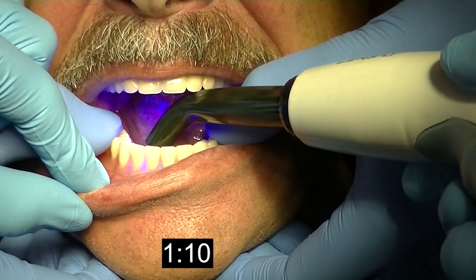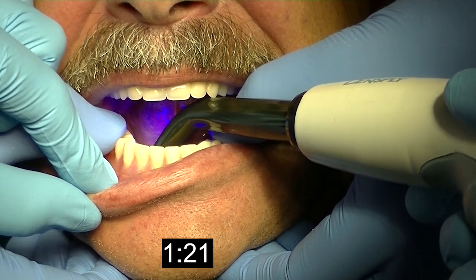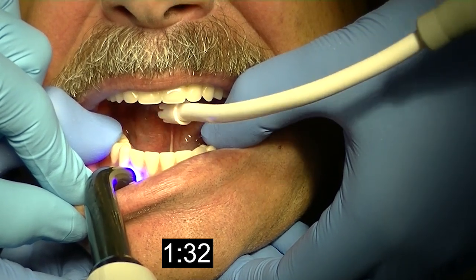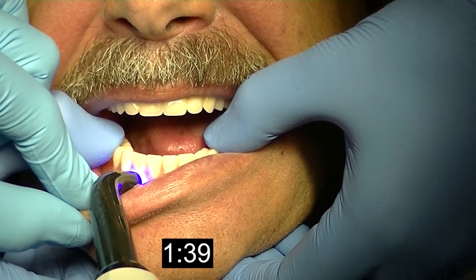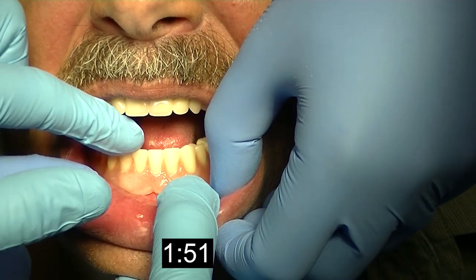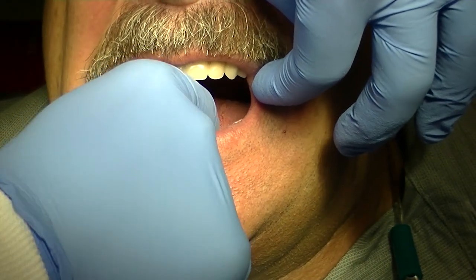Again, holding a gentle finger pressure around the complete denture, my assistant would be light curing the denture and the slopes while I'm holding the denture. As we approach the end of the light curing cycle, I'm just going to take my fingers and verify that the attachment seemingly is going okay up to this point, just verifying I have retention and stability. I like to disengage from the posterior aspect of the complete denture — I find it easier to remove when you grab it from the back part of the denture.